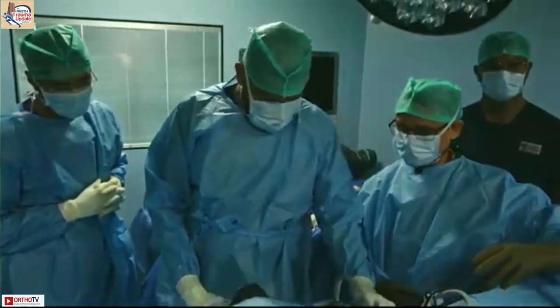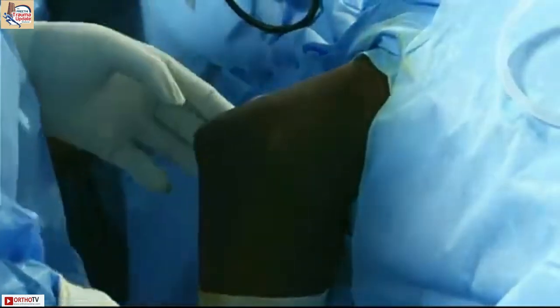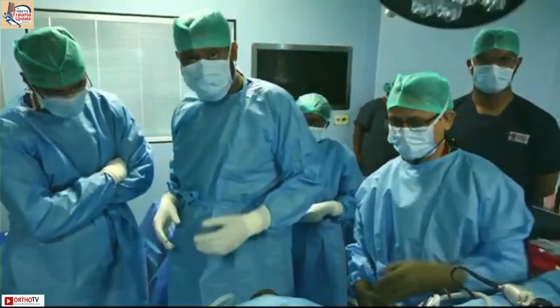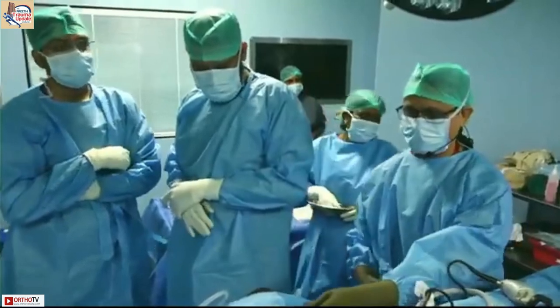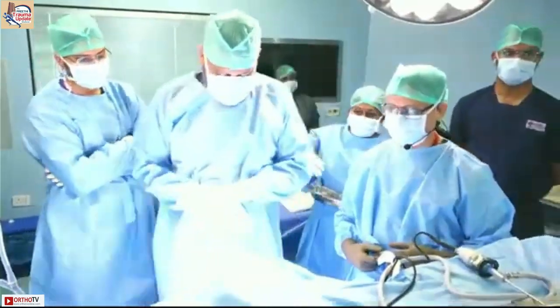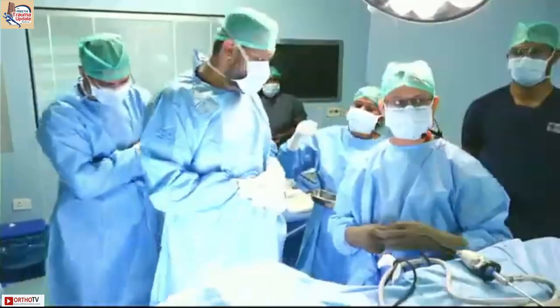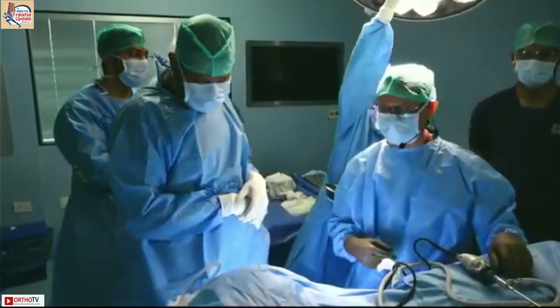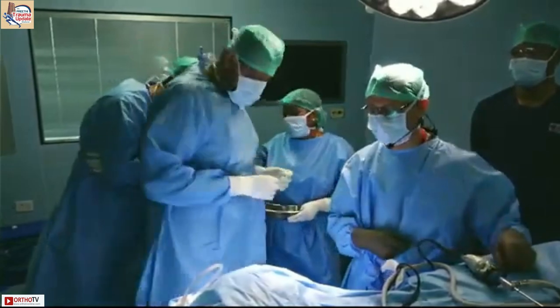Okay. But I think the video people do scopy in prone or supine. Yes. For the audience, you can do scopy in supine, but you need hand traction or hand holding for that in supine. Lateral is the easiest position to do scopy because a lot of work is done with your hands towards the patient's head. Posterior compartment: the biggest advantage is the posterior compartment is oriented well. You're working from the top rather than working from the front in a supine position.